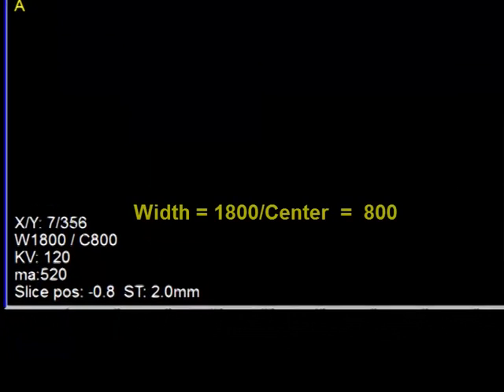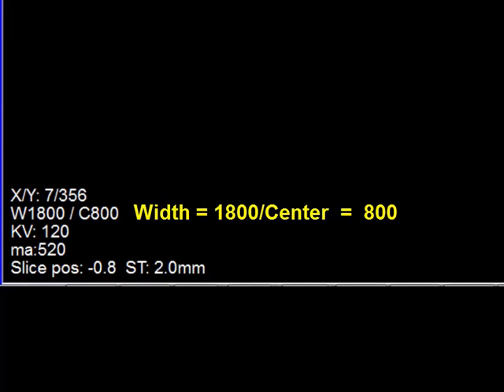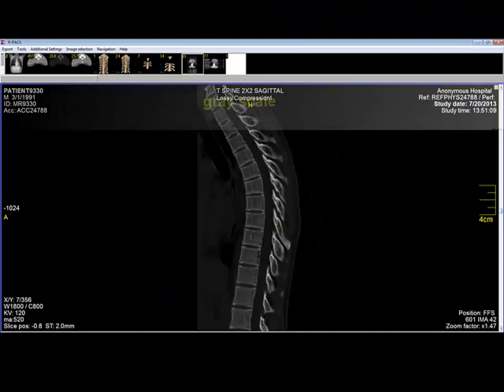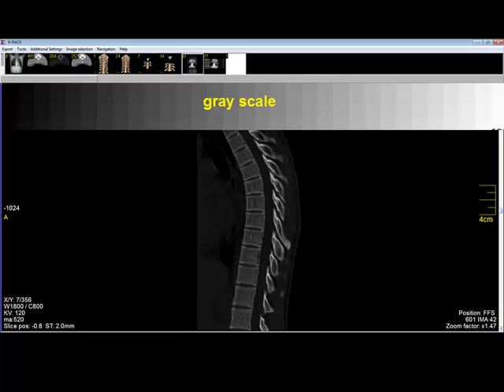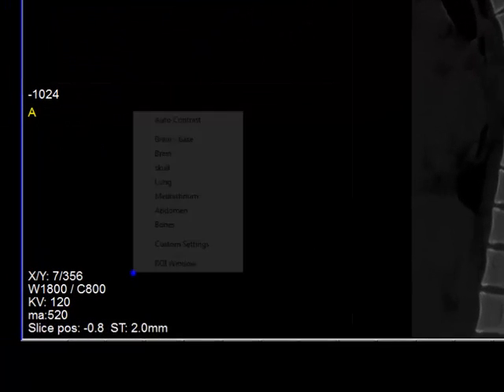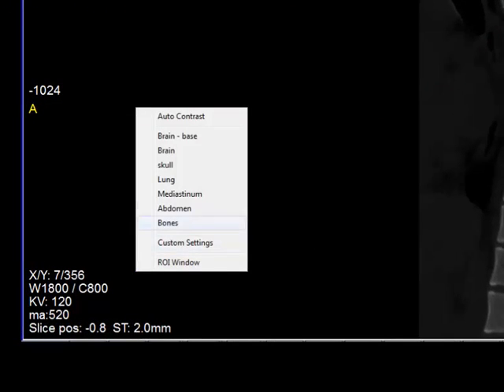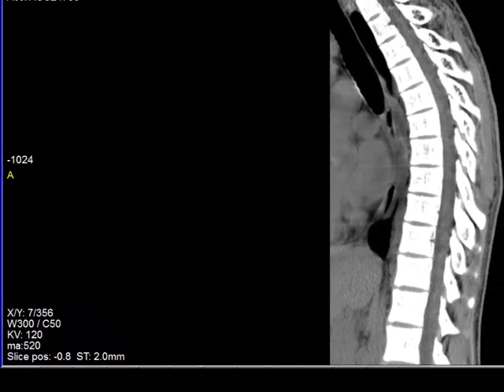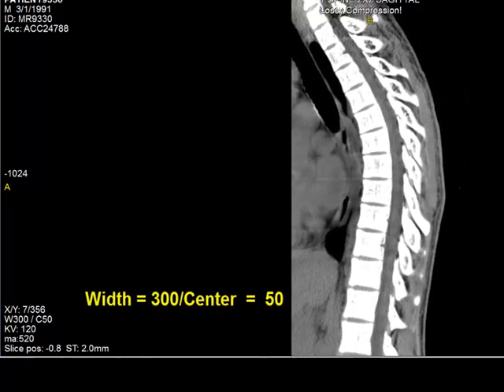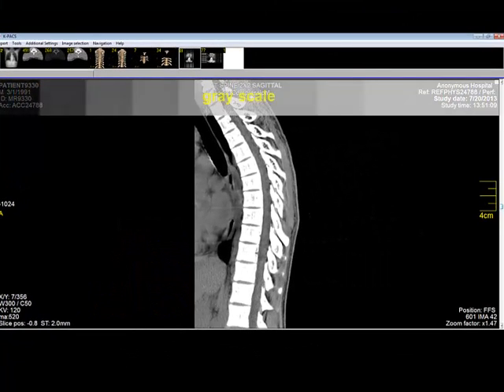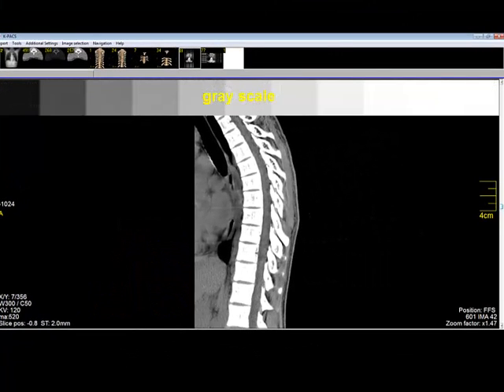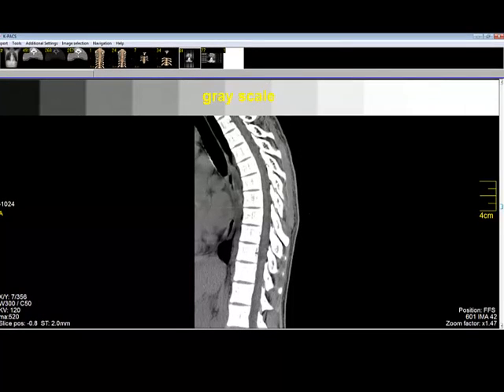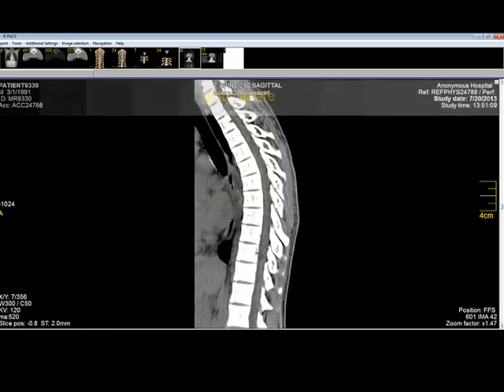Notice that the width is now 1800 and the center is 800. In other words, the window width is displayed in 1800 grayscale values. If we went back to mediastinum the window width would be 300, so there are 300 grayscale values being displayed in this image going all the way from black to light.